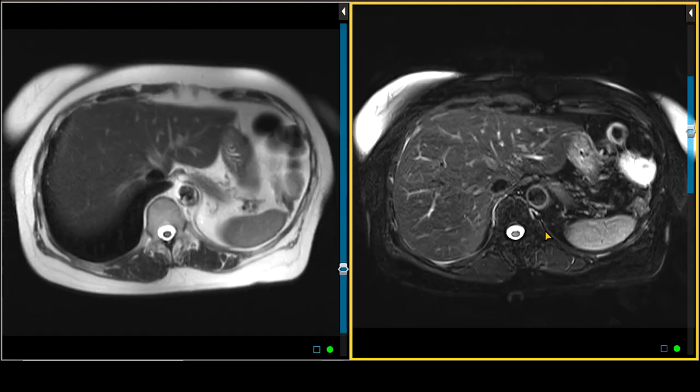On the other hand, if the liver lesion has a T2-weighted imaging appearance that's similar to the spleen, I know that it may be something benign, but it could also be something malignant and something I need to work up even more.